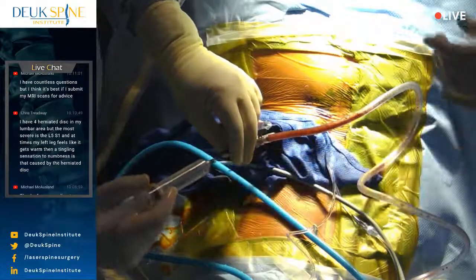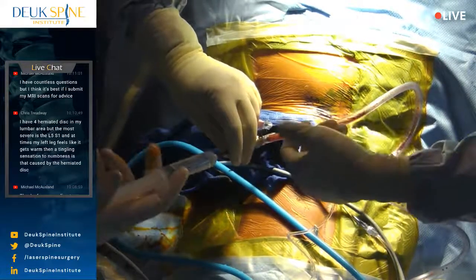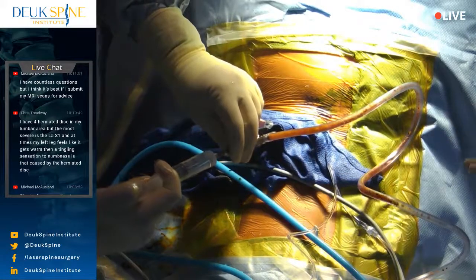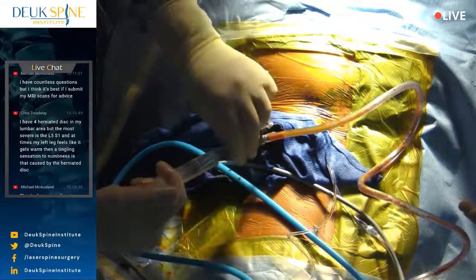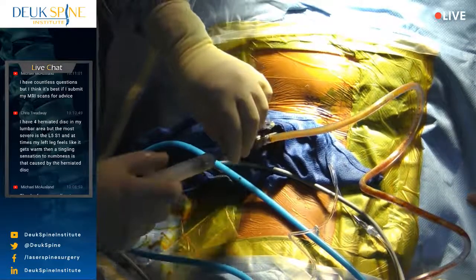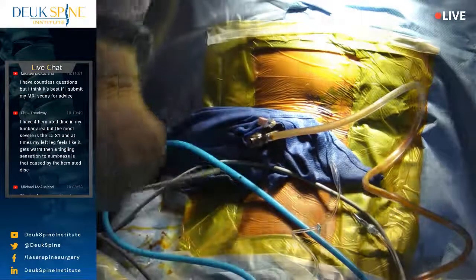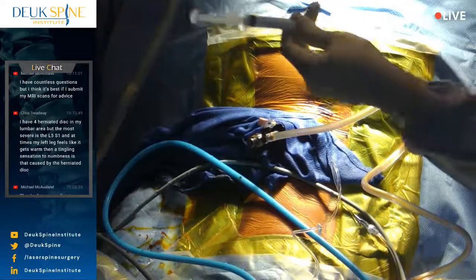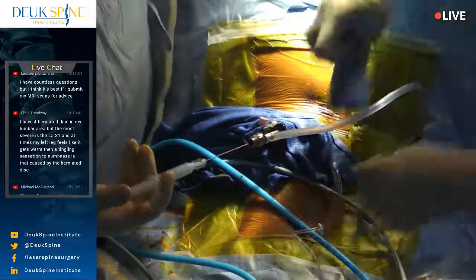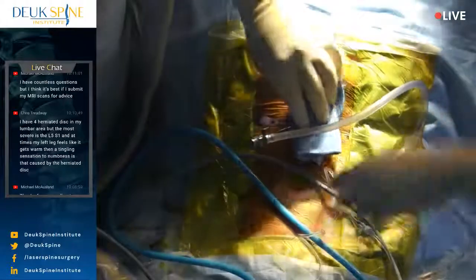Let's see, Luis. Success! No, I think it's good. Is there anything bigger than a 22? The next one is an 18. We try the 18. All right, so that's L5-S1, one down, one to go.